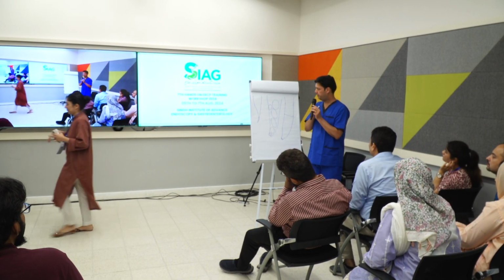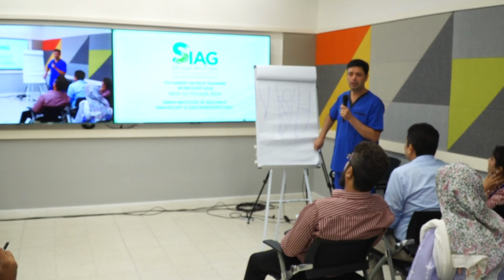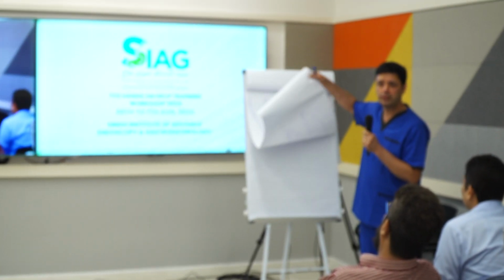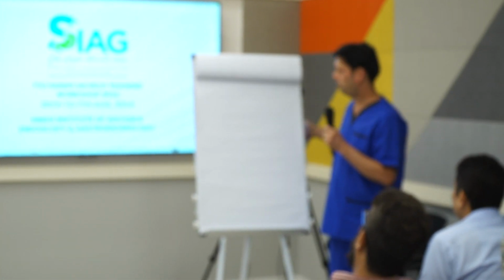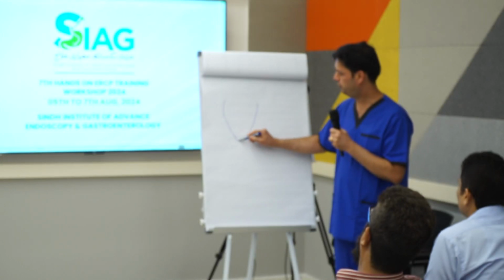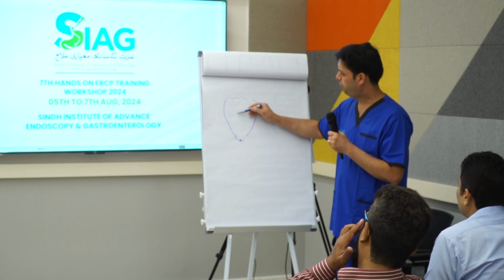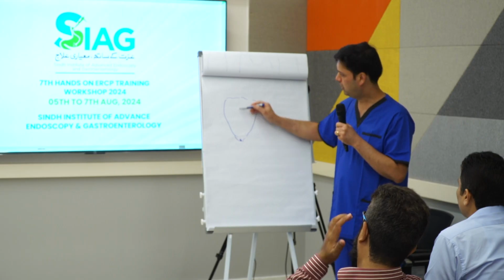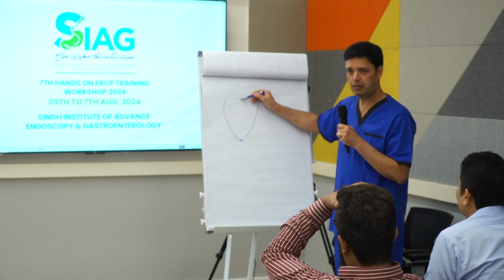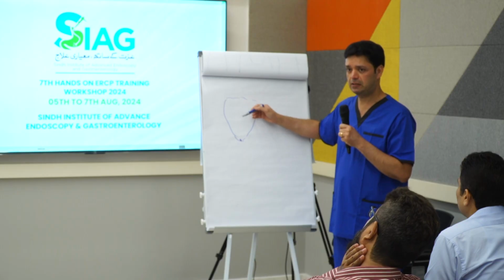So you have to look at the ampullary morphology, and also the number and size of the stones in the duct is important. Sometimes you've got a big ampullary morphology, a bulged ampulla, and if you want to size the sphincterotomy, you can go till the end here, but sometimes you'll not know that is the end of the duodenum, so you have to reassess it.